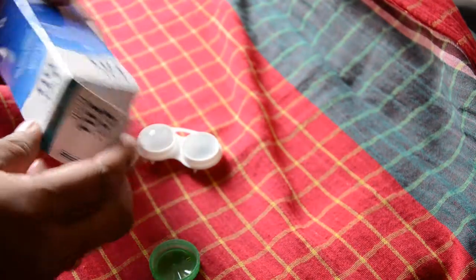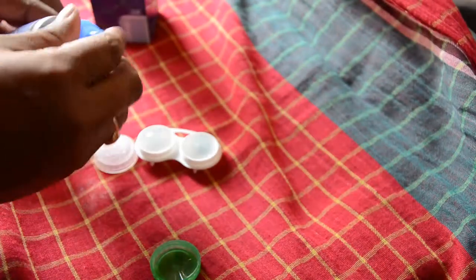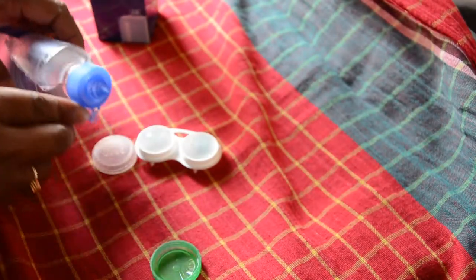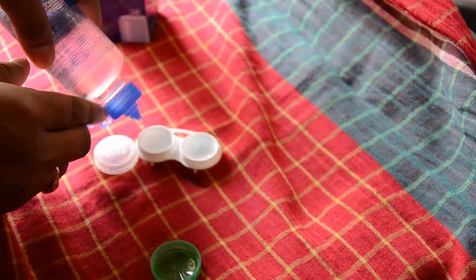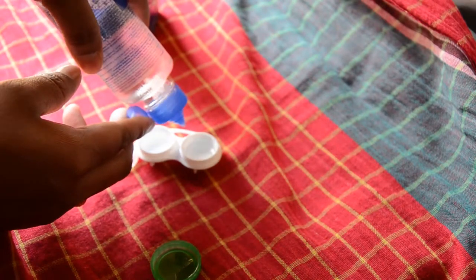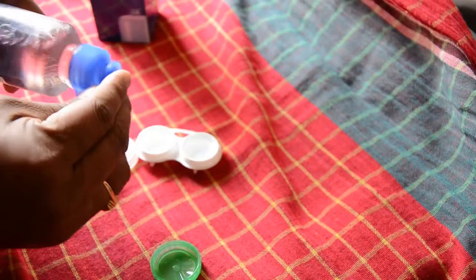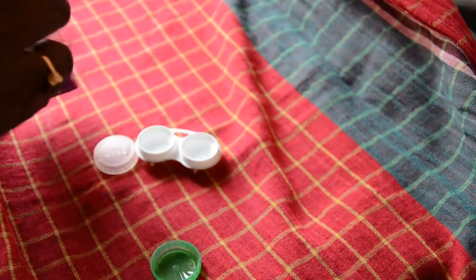Now you can clear it out. This is the kind of liquid I'm using, but based on your location and preference, you can choose the one you have. You can pour the liquid on either side of it. Make sure you don't fill it up to the brim — leave some space to get it screwed properly. Close this one, put it in the back and place it beside.